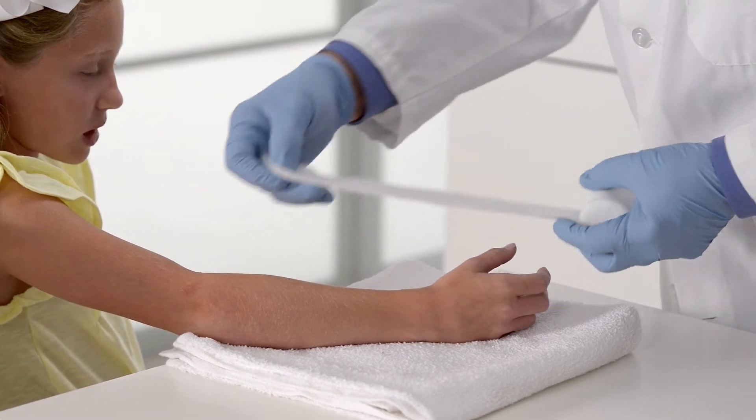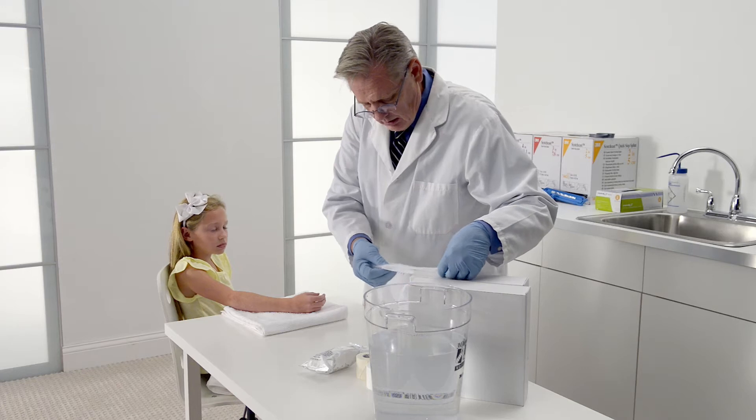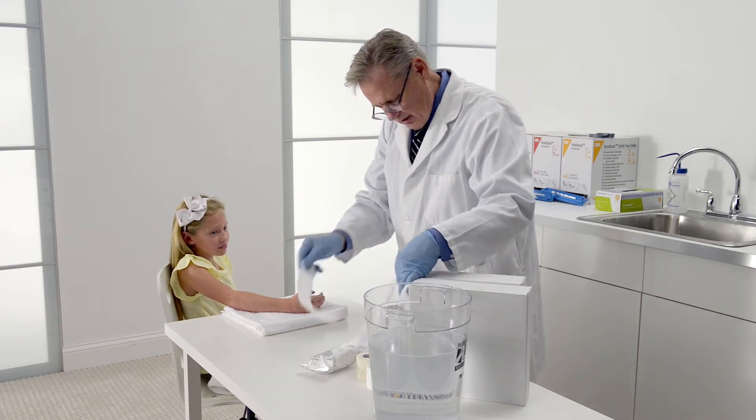Make sure the patient is in a safe and comfortable position and ensure you're able to easily cast the arm and maintain proper body mechanics. Let's get started.